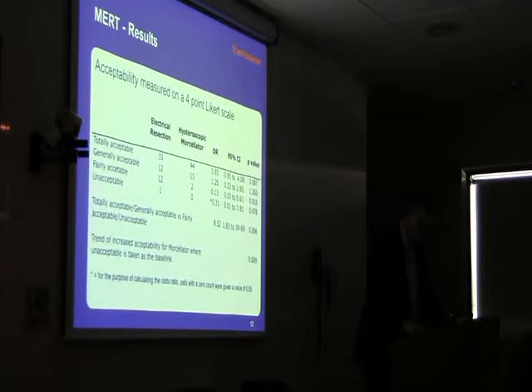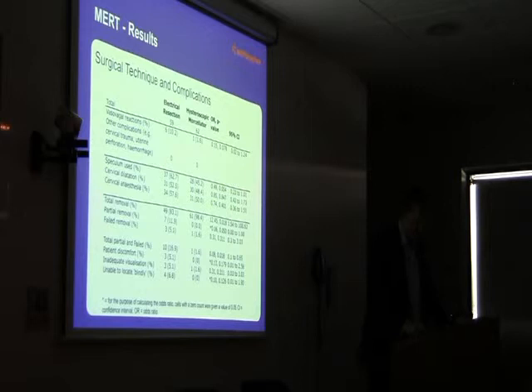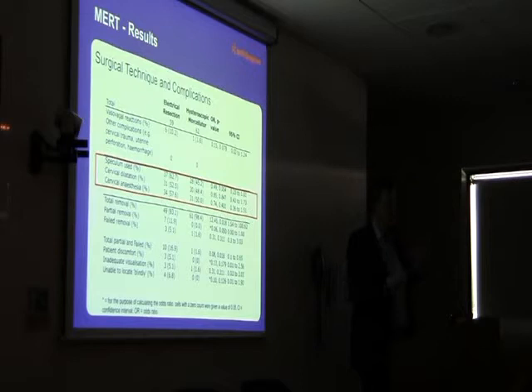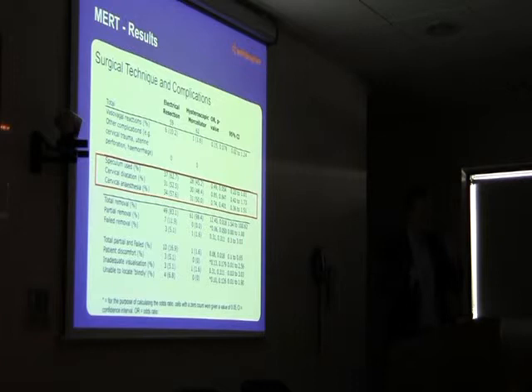And then the other thing is to look at other surgical outcomes, and I won't go through all of them with you, because you can access the paper. But interestingly, the thing I love about the Alpha scope, the VersaPoint, is it's very small. You can do vaginoscopy, you can go in, it's a nice long scope, beautiful scope. You have to get used to the offset distal lens with the morcellator.